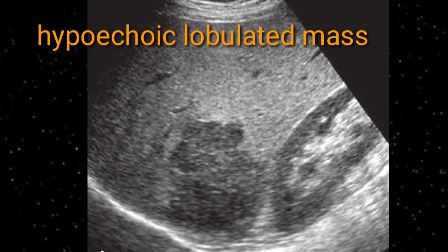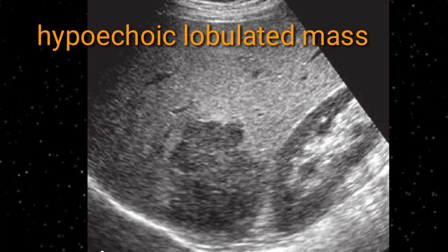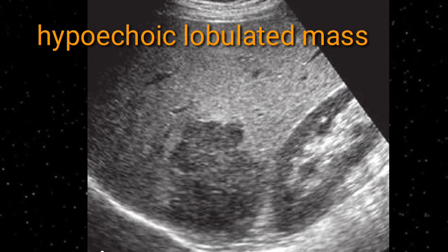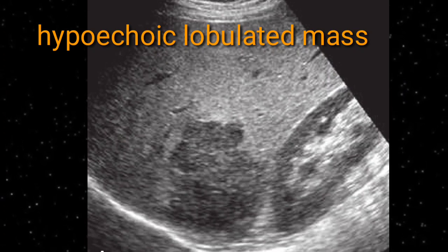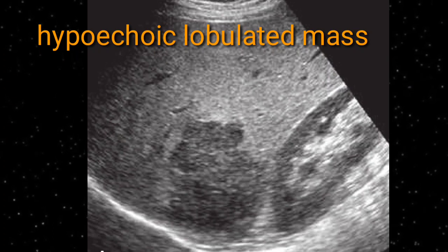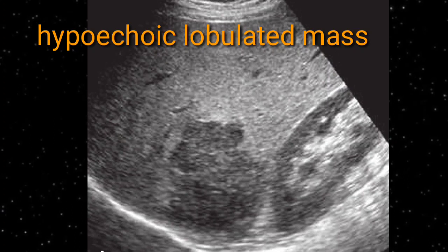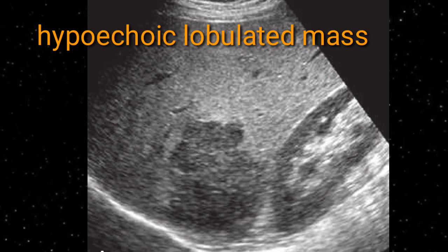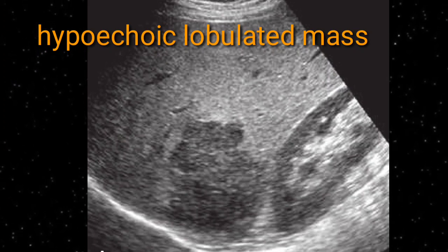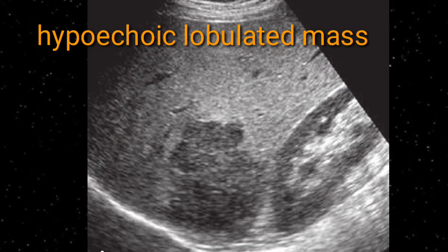In this slide, the right lobe of the liver shows a well-defined hypoechoic lesion. The right lobe is occupied by a well-defined hypoechoic lesion. This lesion shows marginal irregularity. Its margins are irregular, therefore you can call this tumor a lobulated mass. Mention the size and site of the tumor, mention its echogenicity, and also discuss its marginal irregularity. Put the Doppler signals on the tumor and look for vascularity as well.